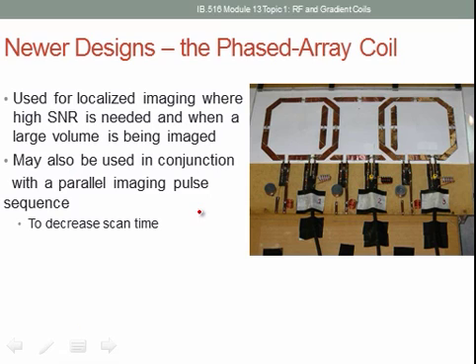So let's see if I can draw the spine here. Here's the spine, spinal cord. Now, if you lay these surface coils like this on the spine, forgive my art again, here's the spine. So now what you've done is you've covered most, if not all, of the spinal cord with one effective coil.